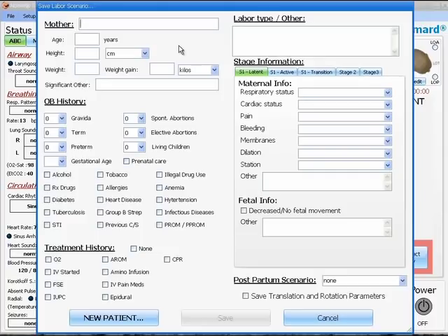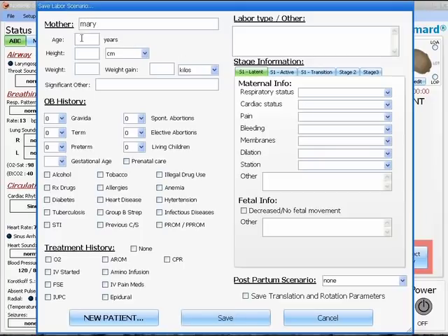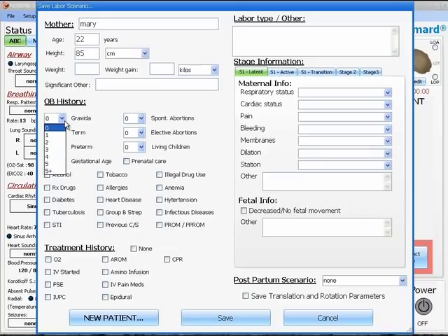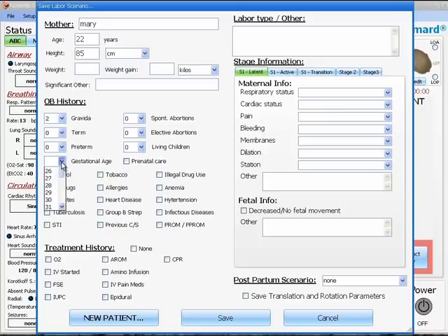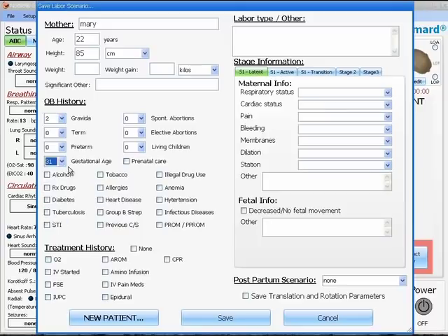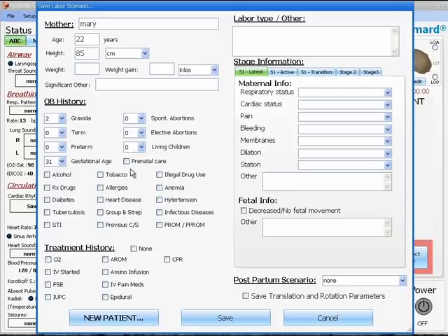A new window will appear. In this window, on the left hand side, you enter information regarding the mother-to-be, including age, height, weight, weight gain. You can also fill out the OB history of the mother. You can put in the gestational age of the fetus, the gravida and para, whether or not she has had any abortions, whether or not she has had any prenatal care. And if you wish to add complications to your scenario and have the mum be diabetic or allergic or any of those, you can add them in as well.